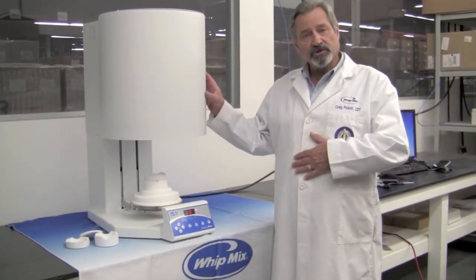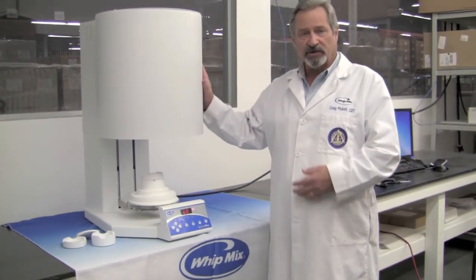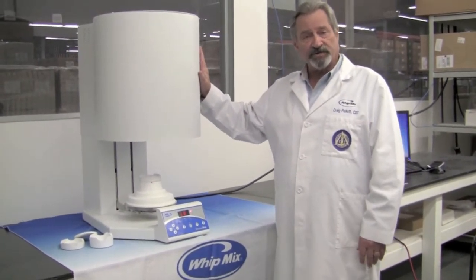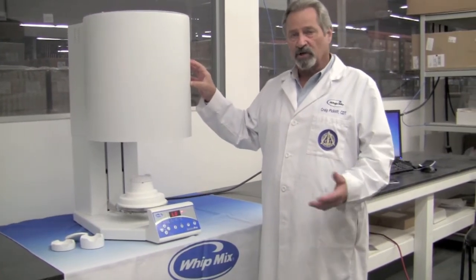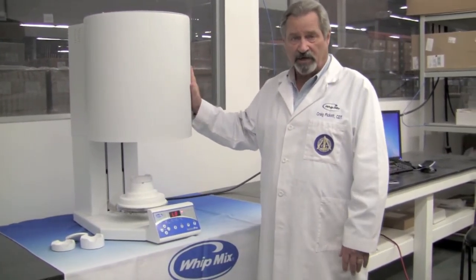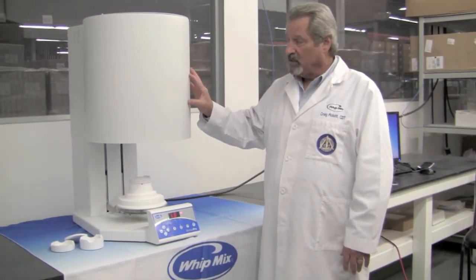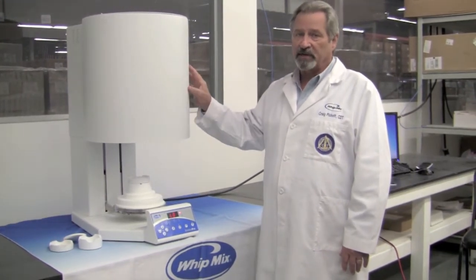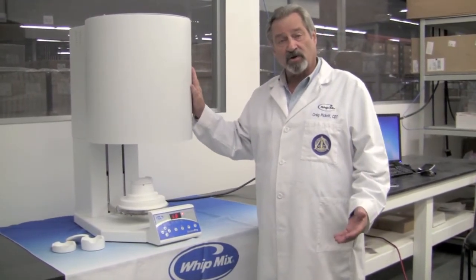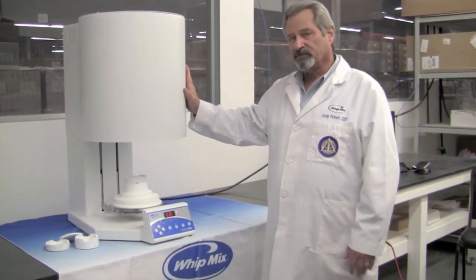Today I'd like to introduce you to the new furnace from Wittmix Corporation, the Sinner Pro. This is a sintering furnace for zirconia. It can be used in a large production laboratory or in a small laboratory — it just depends upon your particular usage. This is a 4-stage, 30-program furnace, so you have plenty of capability to use any type of zirconia that you are using currently or would like to use in the future.